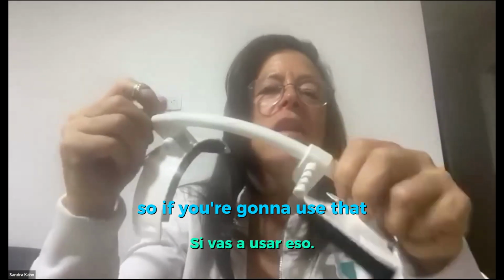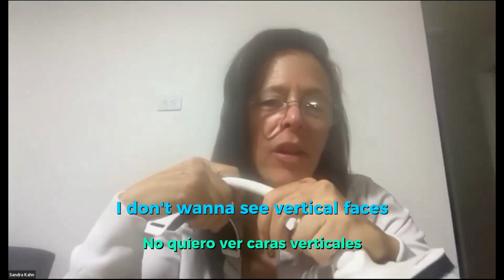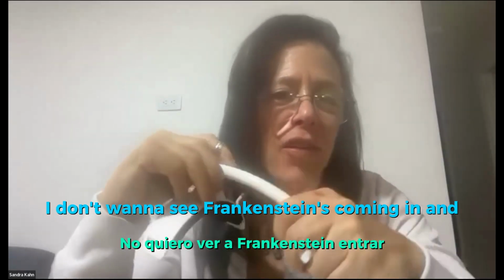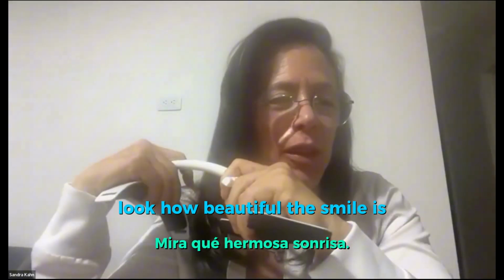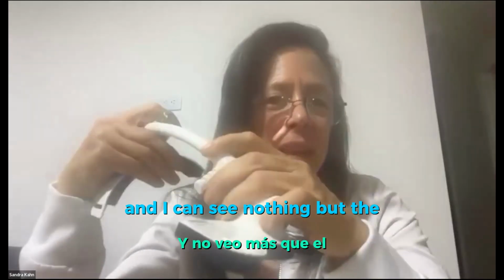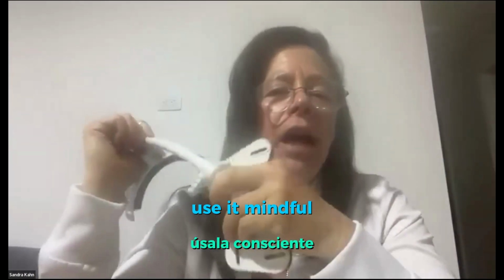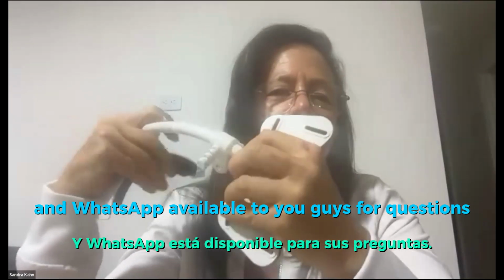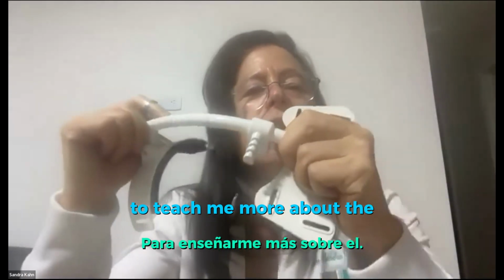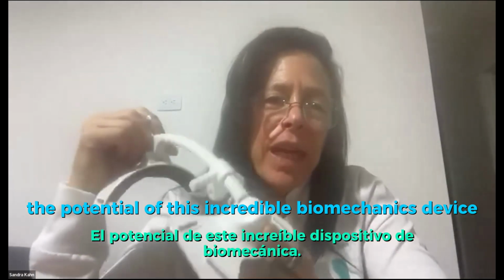So if you're going to use that, be mindful of that vertical component. I don't want to see vertical faces. I don't want to see Frankensteins coming in and saying, we fixed the teeth, look how beautiful the smile is, and I can see nothing but the long face. So it's a tool. Use it mindful. My team can have my email and WhatsApp available to you guys for questions. And I would love for everybody to teach me more about the potential of this incredible biomechanics device.